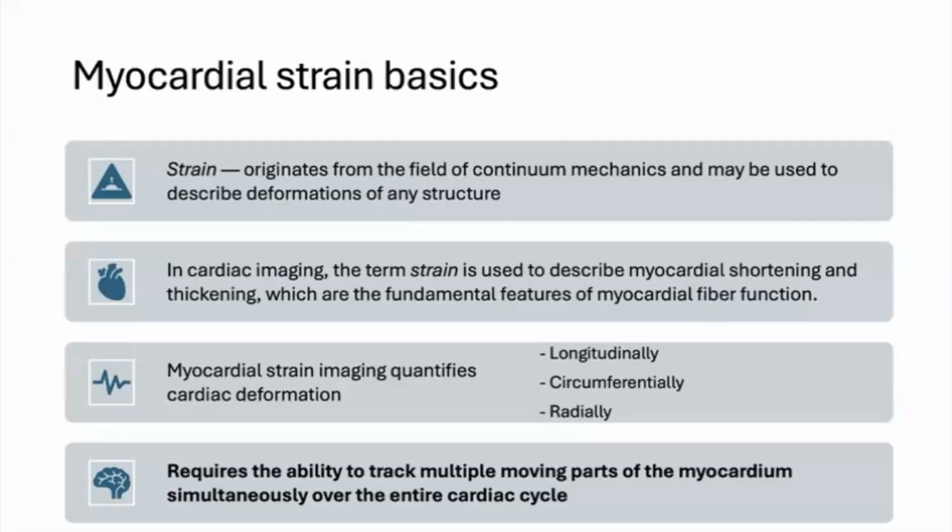And in order to perform a strain analysis, whatever the technology being used, I think it's just important to understand that regardless of the technology, the underlying requirement is the ability to track separate moving parts of the myocardium simultaneously over the cardiac cycle, seeing how they're moving individually and how they move in relation to each other and the walls on which they are located.